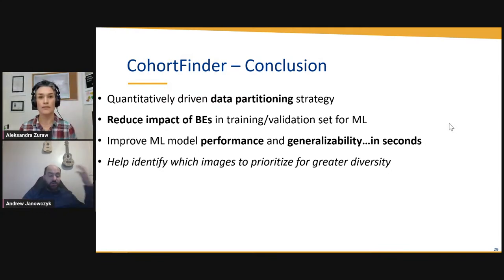So you can say, well, we're going to use a lot of augmentation when we train our deep learning classifiers, and we're going to use stain normalization, right? So there are a lot of implicit ways that we've tried to deal with this issue. I would argue that most of them are pretty computationally expensive. Instead, you can just pick a different slide. And a lot of those techniques, I don't think, are going to fully compensate for it.